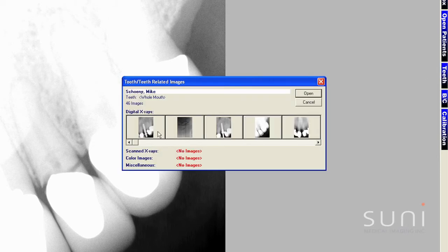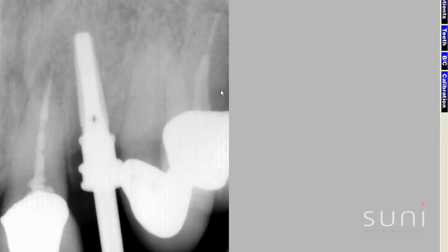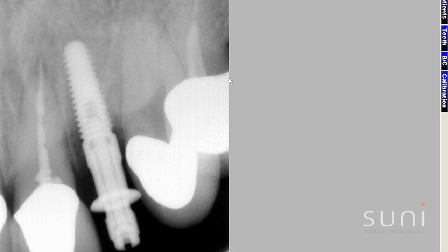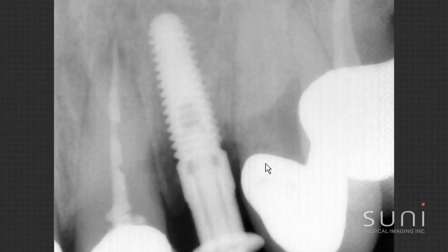I need to take a pan so I can get a 3D image — a cone beam — because now I'm going to put an implant in. Stage one on the implant: a quick picture, and then we'll take one with the implant screwed in. Again, I get confirmation that the collar is down to the height of the bone and the implant is right close to the bottom of the hole that I drilled, so I know he's going to be good to go.